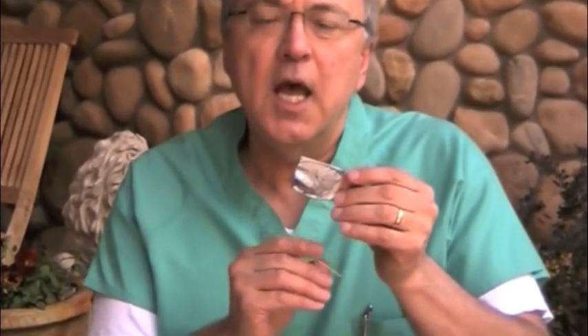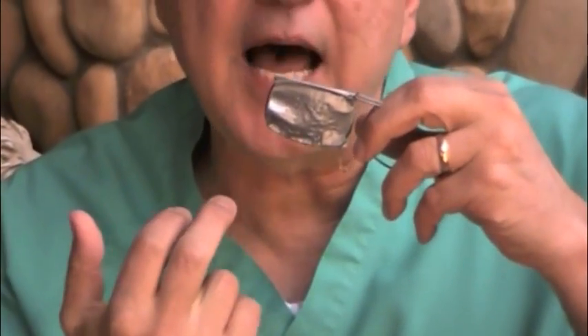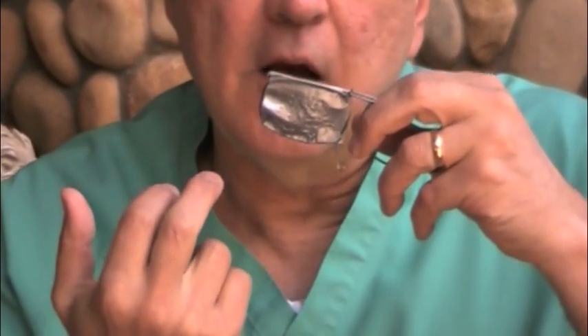Hi, this is Dr. Hubbard. I published the website TheSurvivalDoctor.com, and today I'm going to show you how to make some pinhole glasses. They've been around forever — eye doctors know about this optical physics and have always known about it. If you look through a little pinhole and you have bad vision, it tends to focus the light back better on the back of your eye and gives you sharper vision.